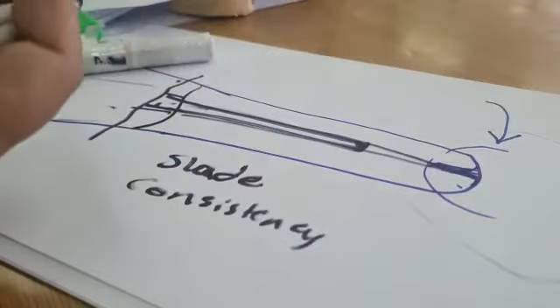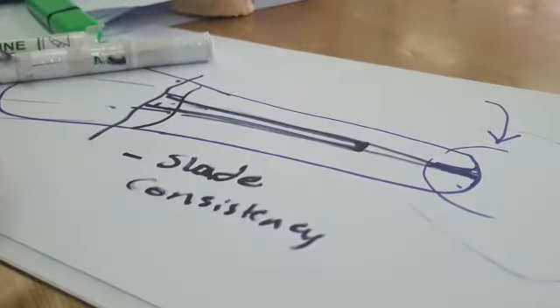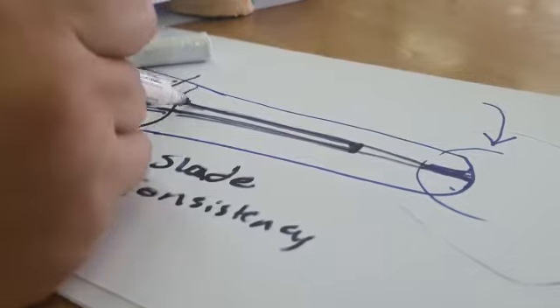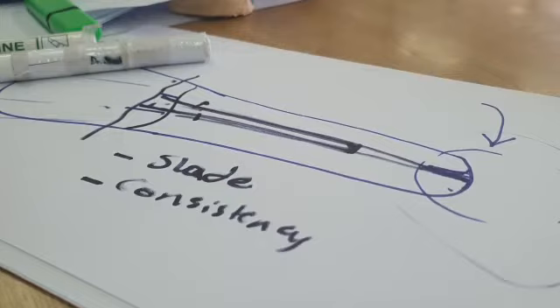You're depending on your tactile sensation. So they have the same shade if you're looking from the coronal, and they have the same consistency to your tactile sensation through the drill. So how do I know I'm not zipping here or ledging here? I have a problem. I'm not sure how do I do it. So how to solve this?